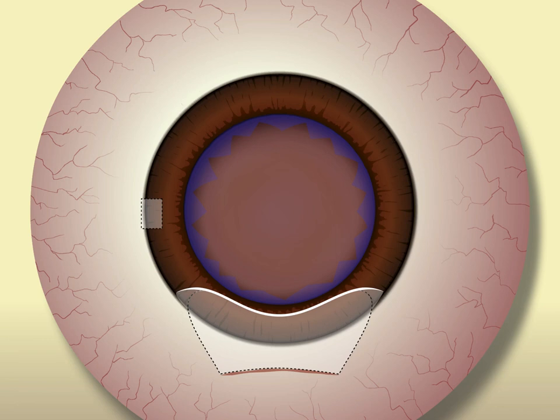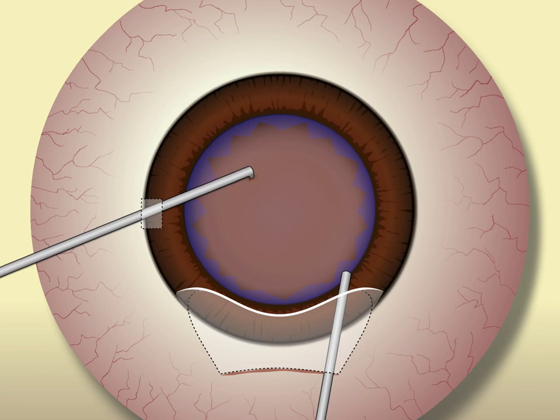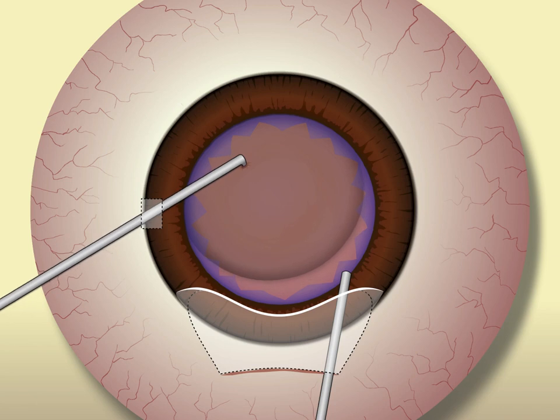The greatest challenge facing a surgeon inexperienced in performing manual extracapsular cataract surgery is the delivery of the nucleus out of the capsular bag. There are dozens of ways to do this, but one safe and reliable method easily performed by a surgeon experienced in phacoemulsification is what I call the slip and slide technique. The first step is to hydrodissect the nucleus. Then place some OVD in the anterior chamber — not too much — and introduce a bent needle or a Sinski hook into the anterior chamber through a side port. Gently push the tip of the needle or hook into the anterior surface of the nucleus, slightly distal to the center, and gently push the nucleus away from the primary incision while pressing slightly downward. This will cause the proximal edge of the nucleus to rise up slightly.